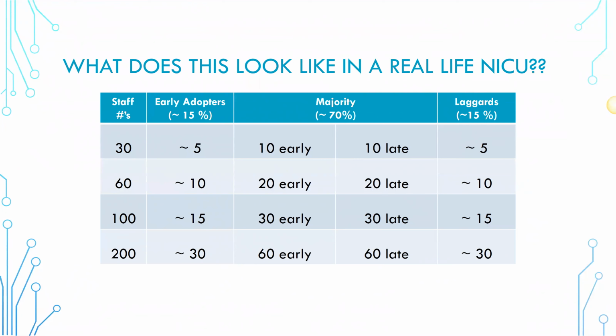I was just wondering what the average cost is to start up a program in a medium-sized NICU. The cost to set up a program, just aEEG? Yeah. So the things that I think you need to consider are going to be equipment, obviously. And so you're looking, depending on if you're just getting one standalone device, you're talking maybe 20,000. If you're talking about integrated, multimodal, full video EEGs, 40 to 60,000. So depending on kind of equipment.